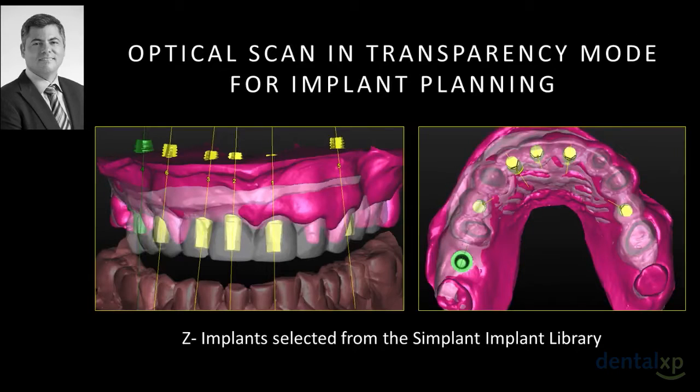What you see now is the zirconia implants being planned utilizing the existing temporary crowns as the point of reference. So doing that, we can actually plan the lateral and the anterior, posterior and superior inferior position of these implants. We also have overimposed the bone, the soft tissues, and we have a perfect reconstruction of this patient. Doing this, we're able to actually select the best position in any kind of area for this patient.